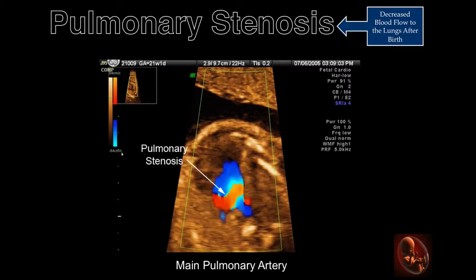This color Doppler image, obtained at the level of the three-vessel view, demonstrates pulmonary stenosis. The color Doppler demonstrates aliasing because of the increased velocity of the stenotic jet.